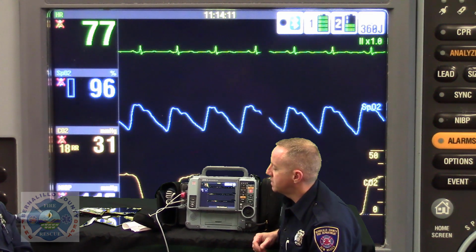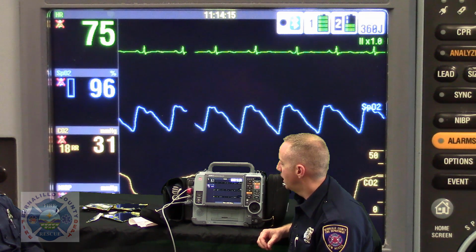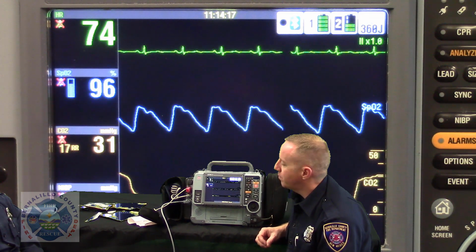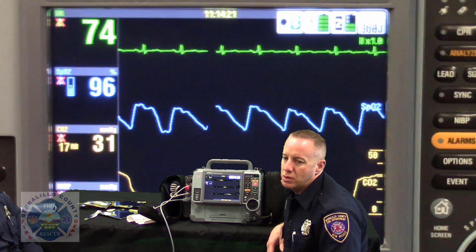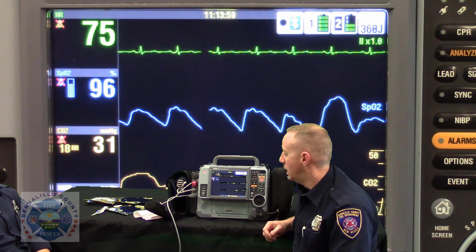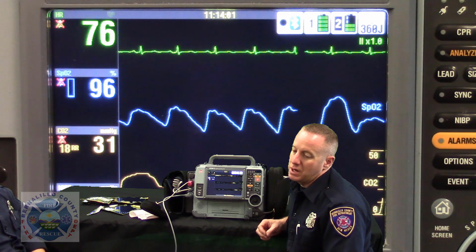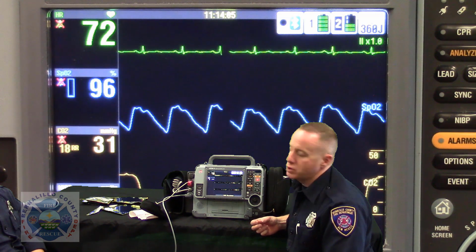We want to know that our electrodes are going to give us the cleanest tracing possible. If an electrode's been out of the manufacturer's packaging for more than 24 hours, it just leads to poor quality EKG, which is probably not interpretable, in which case you're going to have to delay in putting new electrodes on, troubleshooting that.